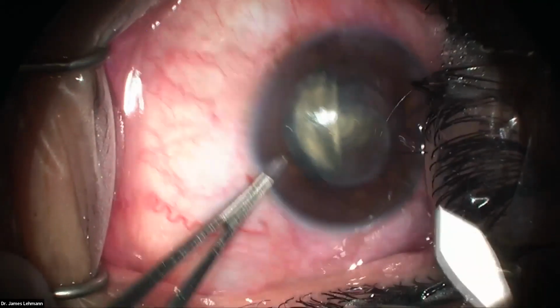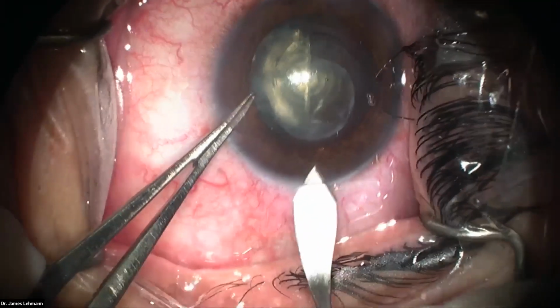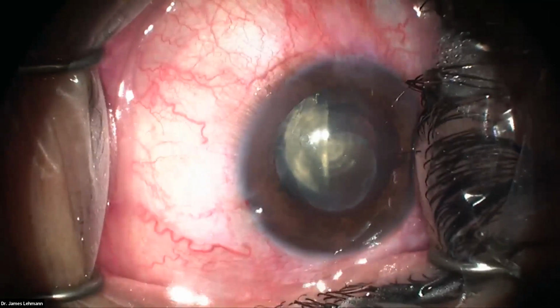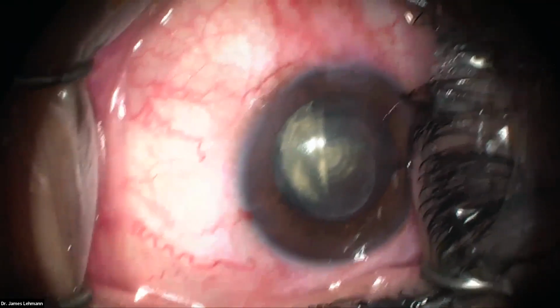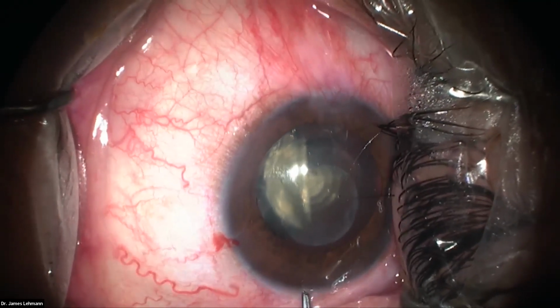All right, now we're going to fixate the globe again and go temporally here, bury the tip right there a little bit, and then in. You can see that, no problem. And then we're going to use the Utrata forceps. I'll get focused in here a little better for y'all. You can see the cap is free floating right there.